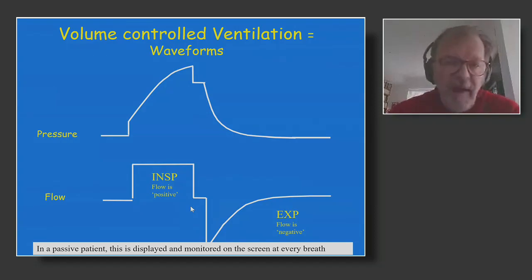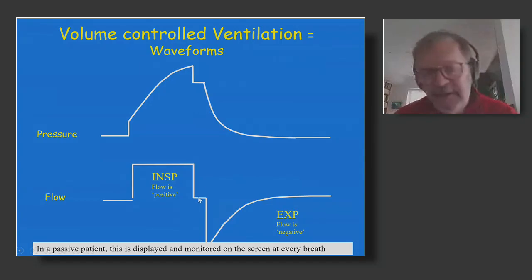You keep the air in your lung, you relax, and this is what happens with this plateau. And this plateau is very interesting because it gives an opportunity for the pressure to go back to the elastic value. I'm going to explain that.